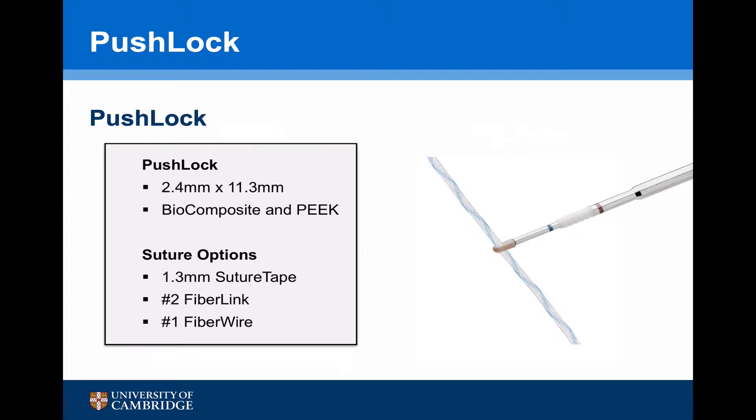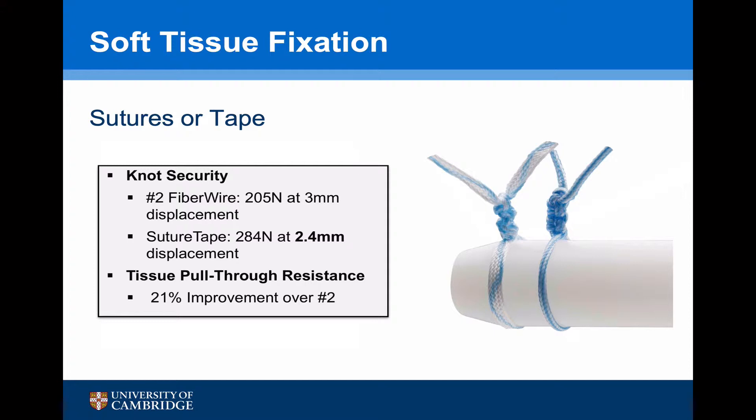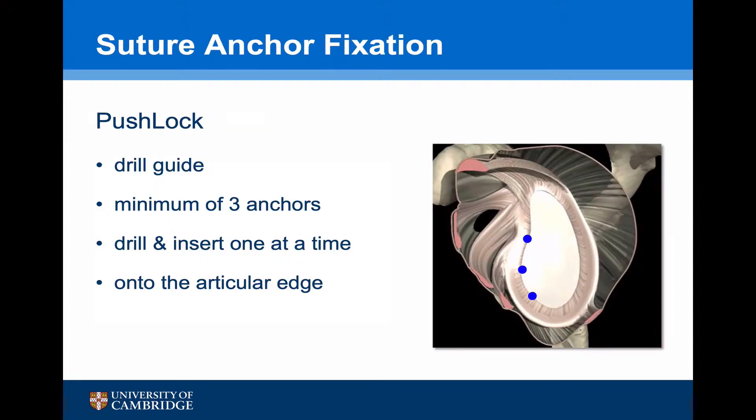For this procedure I'm going to use a push lock anchor — it's 2.4 mm in diameter and 11.3 mm in length. I like to use a biocomposite material and I'm going to use the suture tape, which has some perceived advantages over standard FiberWire sutures. Regardless of the type of anchor used, it's important to always use a drill guide, to use a minimum of three anchors, to drill and insert each anchor one at a time working from inferior to superior, and to put the anchor onto the articular cartilage so the capsule is actually brought up onto the anterior edge of the glenoid.